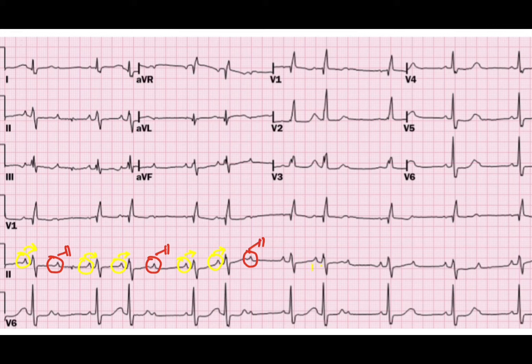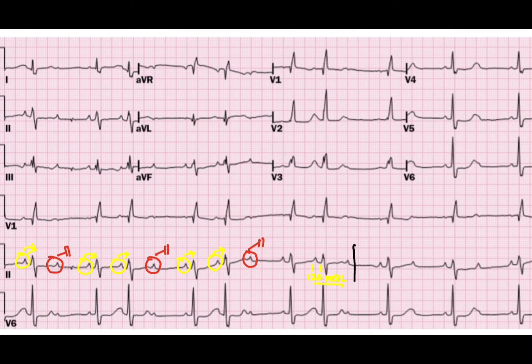But which one? The duration of the PR interval is normal — around 120 milliseconds — so it is not first degree heart block. The PR interval is constant, so it is not second degree type 1 heart block, where the PR interval keeps prolonging until we see a dropped beat. It is second degree type 2 heart block, where the P waves conduct normally through the AV node but then all of a sudden there is a block without affecting the PR interval.